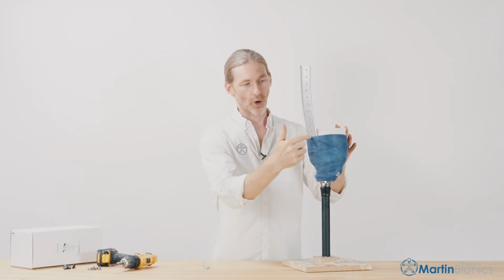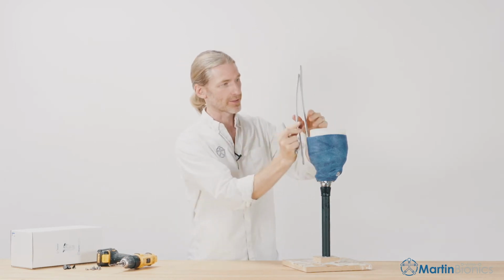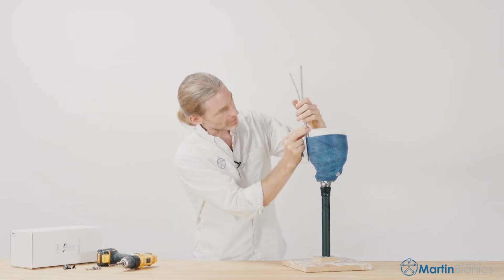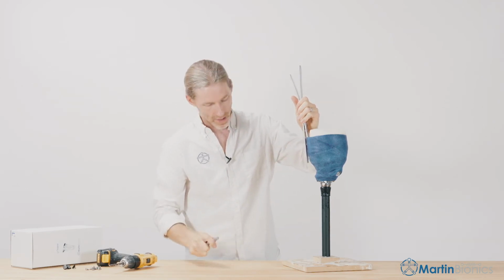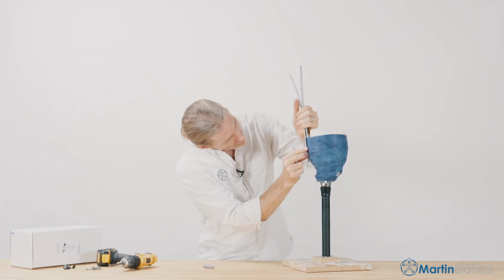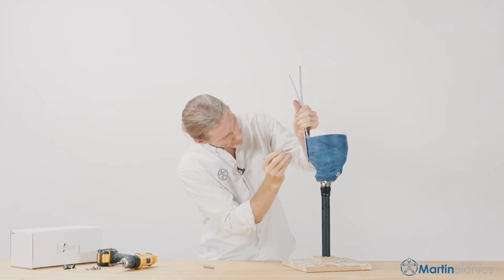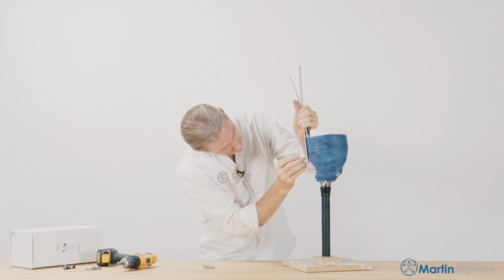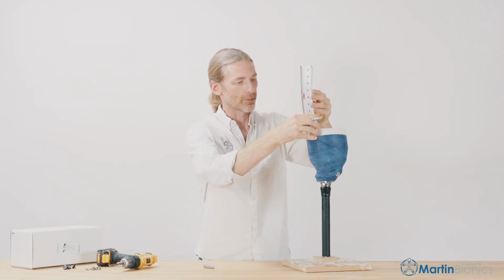So my next step here is I'm going to mark where the holes are, and I'm going to anchor some screws through those. So to measure this, I'm just going to slide one of my struts out, overlay it with the other strut so I know the holes line up, and then I can mark where these other holes are going to be. Those ones are marked. Should key back in place.